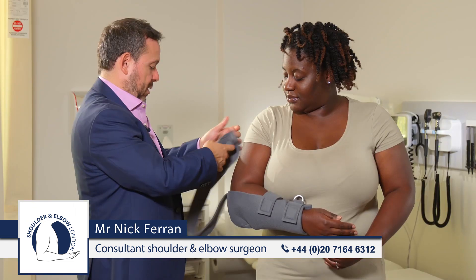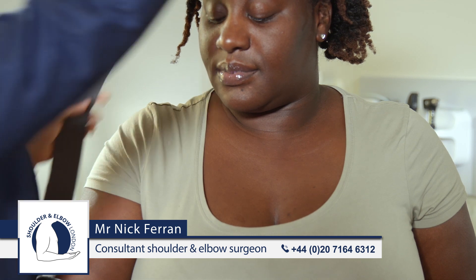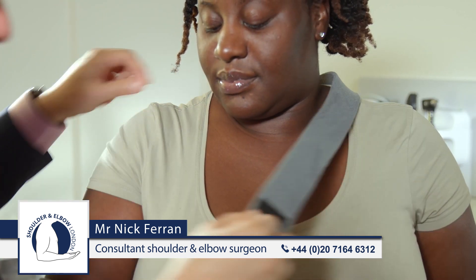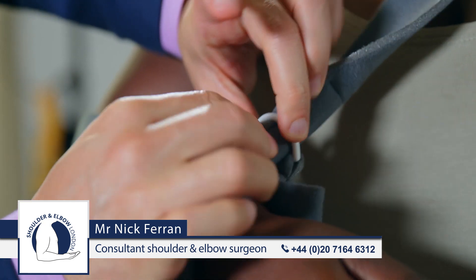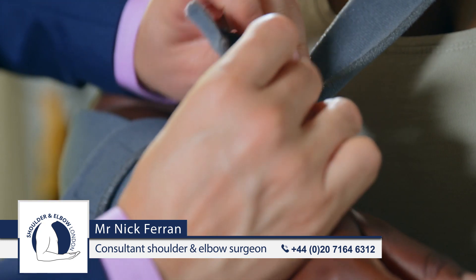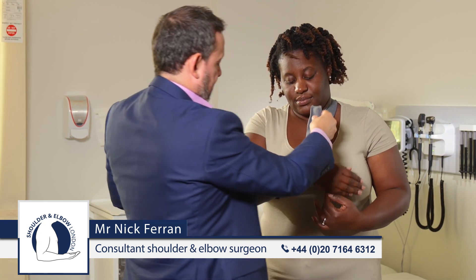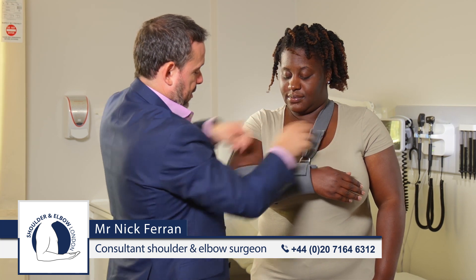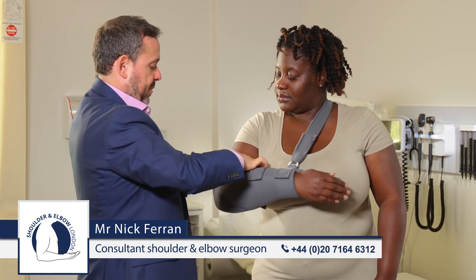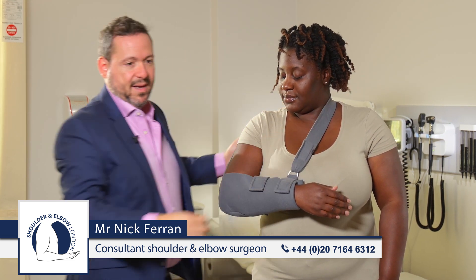Once that's secure, we then adjust the next strap — we pass this around the neck through the loop and adjust the height so that the arm is horizontal. Then we make sure the elbow is snug into the sling and the strap is comfortable on the neck.